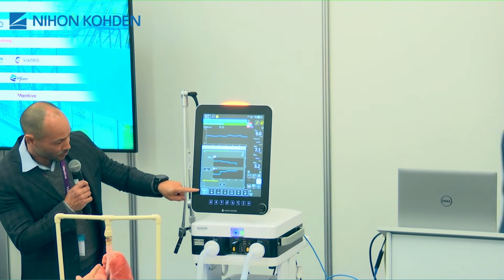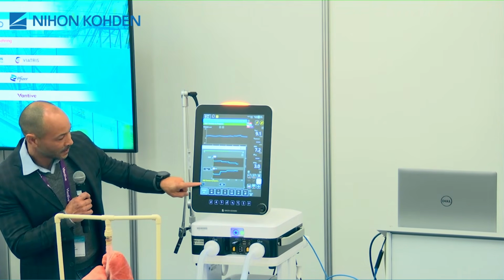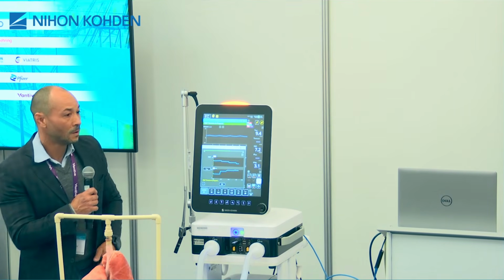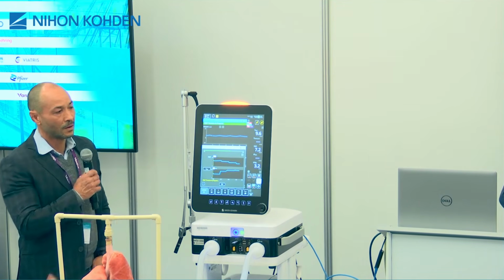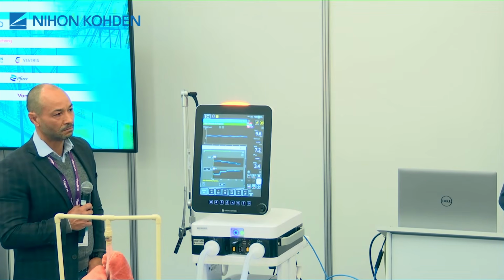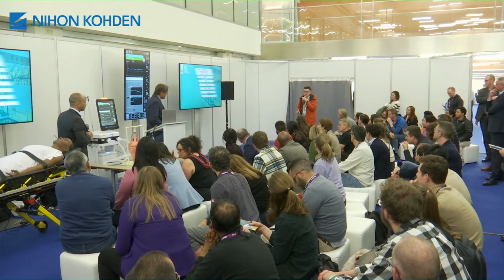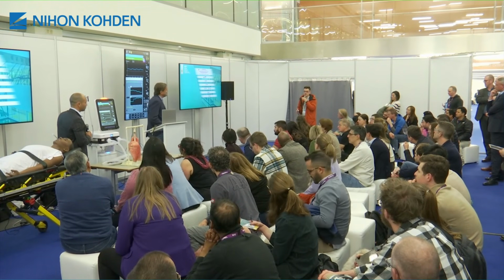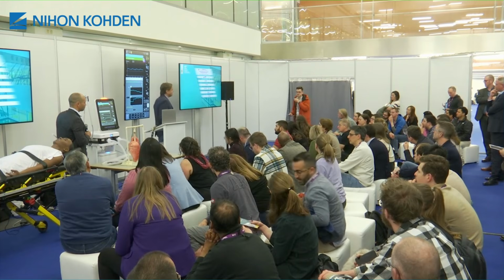Here is pressure control, and here... I have a question. It may sound weird, but if you perform a recruitability maneuver on a patient and you see that this patient is not recruitable and it's still hypoxemic, would you still consider to prone this patient, or would you increase the FiO2?